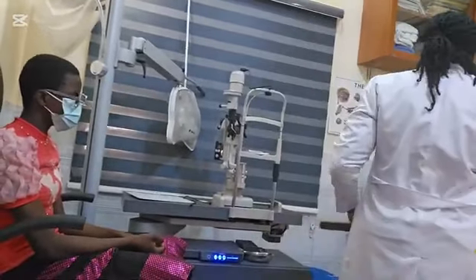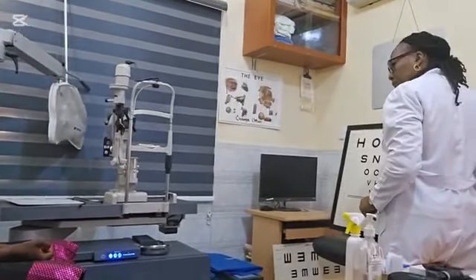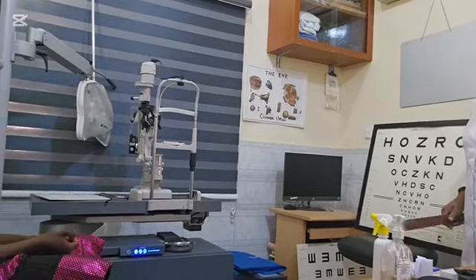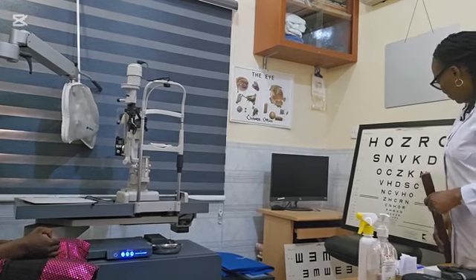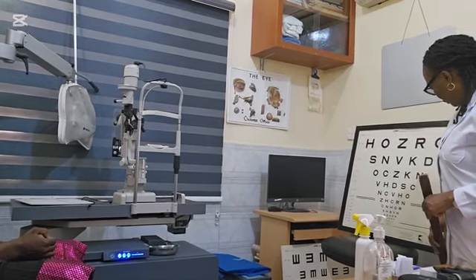Let's do binocularly. Can you read from here? Yes. Go ahead. VNDSC. Continue down. NOVNO.